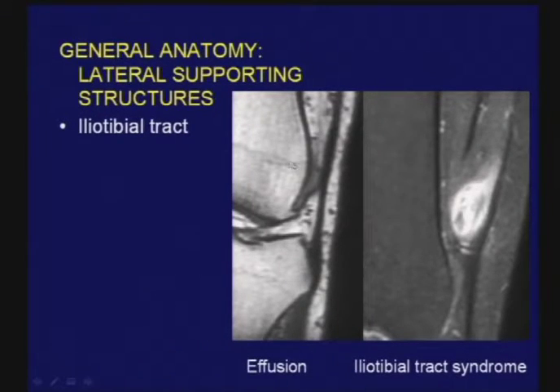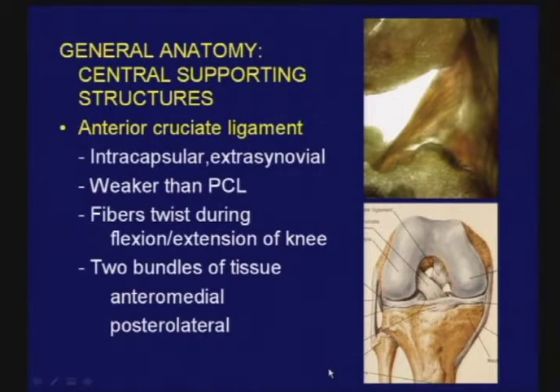Even small joint effusions often first appear just deep to the iliotibial tract. And in the iliotibial tract syndrome, an adventitial bursa forms just deep to it, and edema and fluid may become present within that bursa.